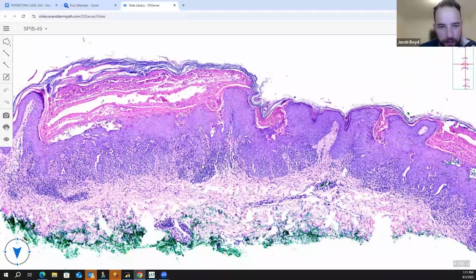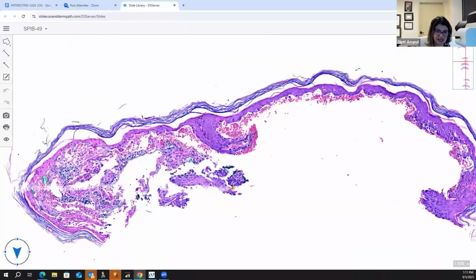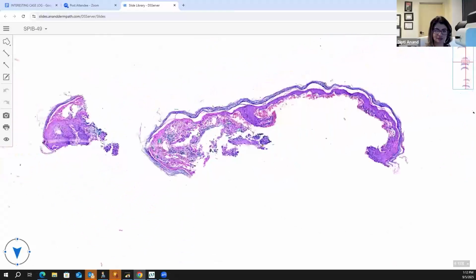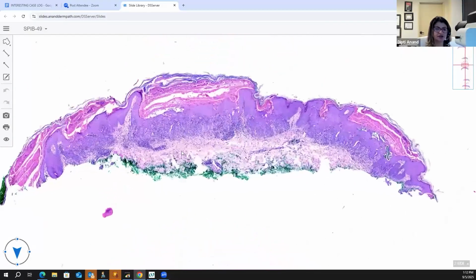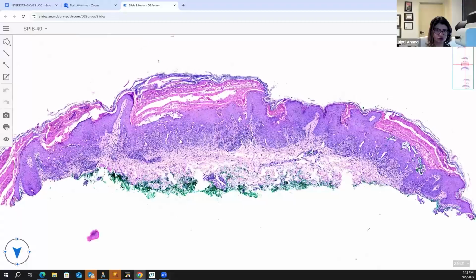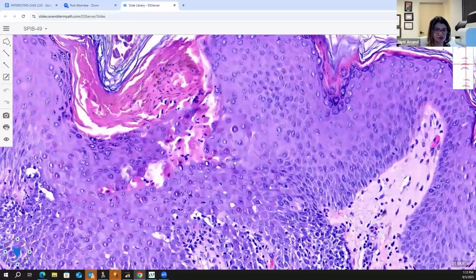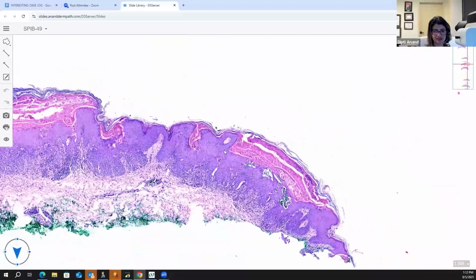Yeah, that makes sense, totally. In TEN, you cannot rely on this, right? Yes, here it looks like that. I completely, 100% agree. It looks like the lacy epidermal sign, but then what about all this? This is not lacy, right? And here, again, because of the things that I said, the change does not begin at the DE junction. It's all acantholytic over here, and the epidermis is very thick, which all go against this being TEN. These are all corps grains in here with some corps ronds. So this is Darier's disease.